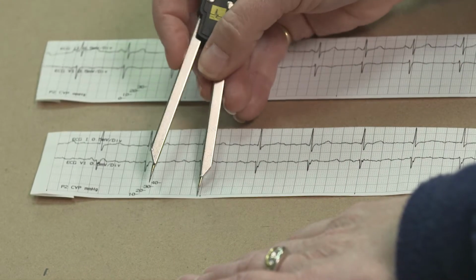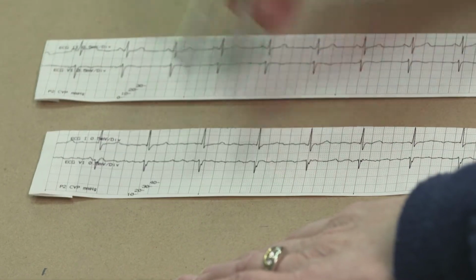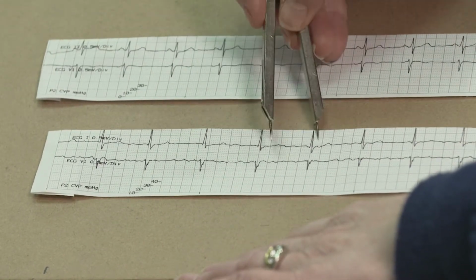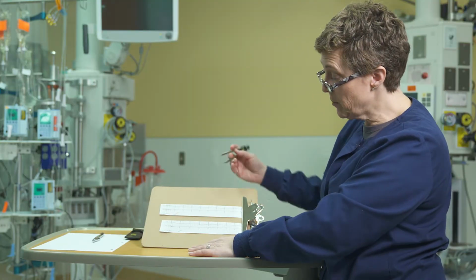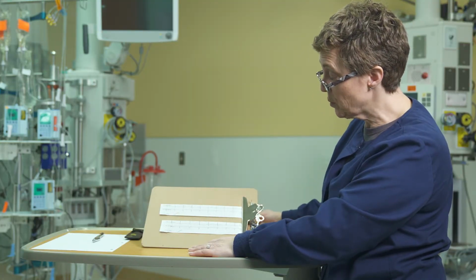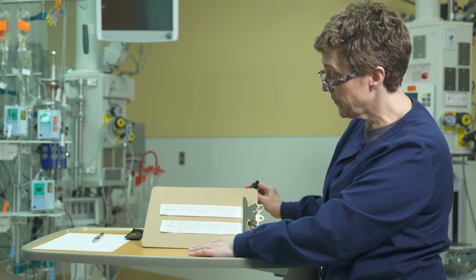So my rate, there we go. There's 1, there's 6 seconds. 1, 2, 3, 4, 5, 6. So about 60. So the rate is okay, but it is irregular and there are no discernible P waves. So I'd be happy calling that an atrial fibrillation.